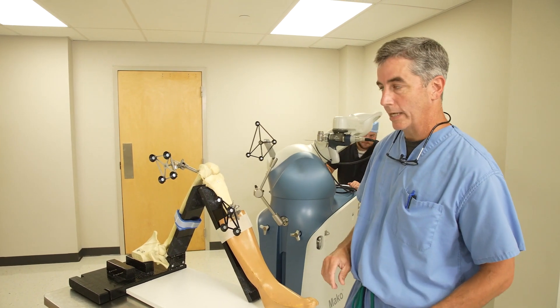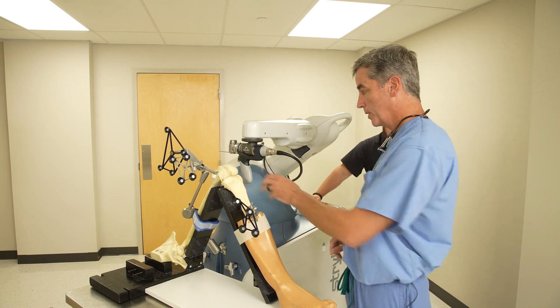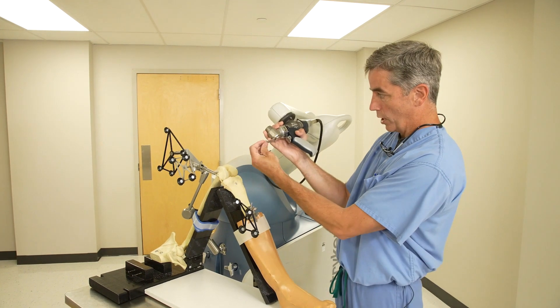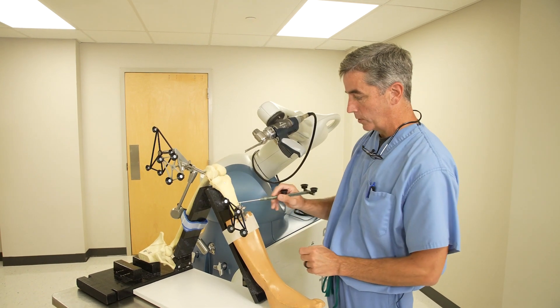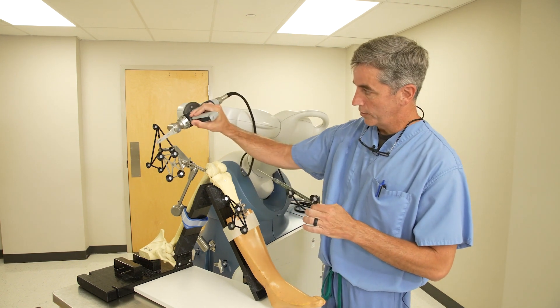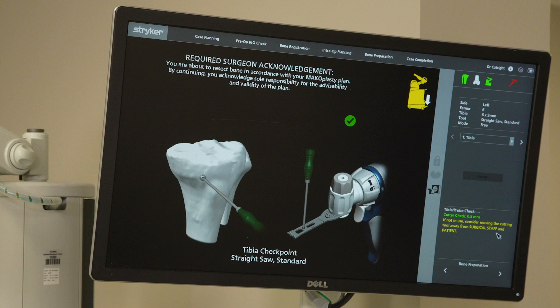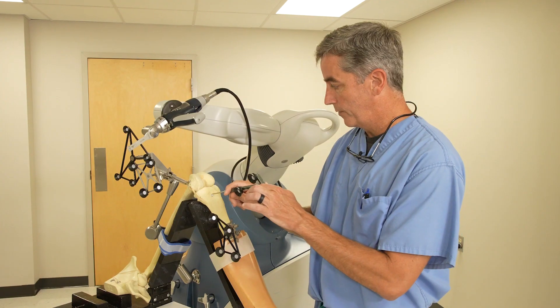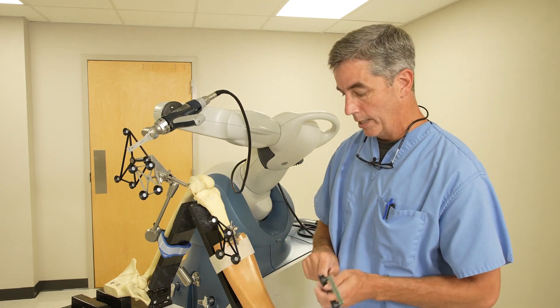Next, the robot is brought in. Everything we've done so far has been to plan the surgery and tell the computer where the leg is. You can see we've got a saw blade here. Every time we do something, we have to confirm all these things are properly secured — if something comes loose, we need to confirm everything is where it's supposed to be so this cuts accurately. The saw blade has a little dot on it and we confirm that the robot knows where the saw blade tip is. And as long as that passes, it confirms the position has not moved or shifted.